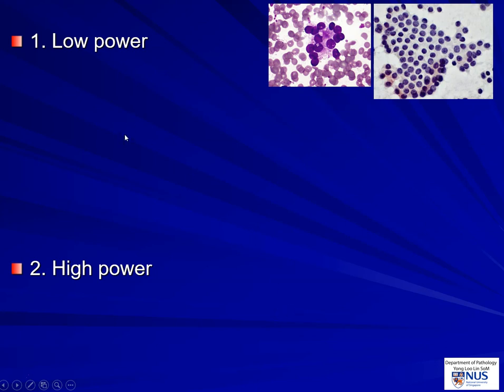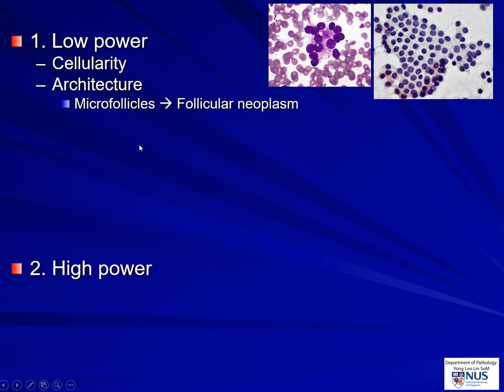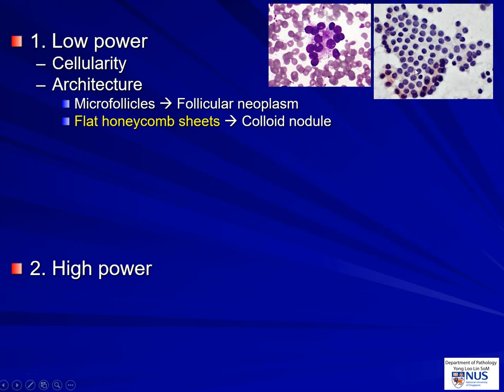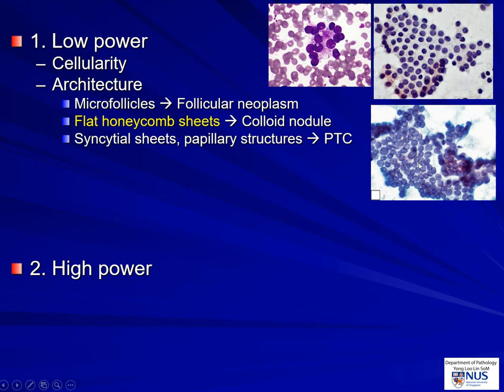When we first look at low magnification, we want to focus on mainly three things: cellularity, architecture — which is extremely important and useful — and background. If we see a predominance of micro follicles, they look like little rosettes with or without a little droplet of colloid in the center. One definition of micro follicles used in the Bethesda system is fewer than 15 follicular cells arranged in a circle or at least two-thirds of a circle. Another important architectural feature is the presence of flat honeycomb sheets where the nuclei are very well spaced and regularly spaced — these are classical in benign follicular nodules including colloid nodules. If you have more syncytial sheets where the nuclei tend to overlap, there is more uneven spacing, some crowding, no clear cytoplasmic borders, or we see papillary structures, we will think of papillary carcinoma.